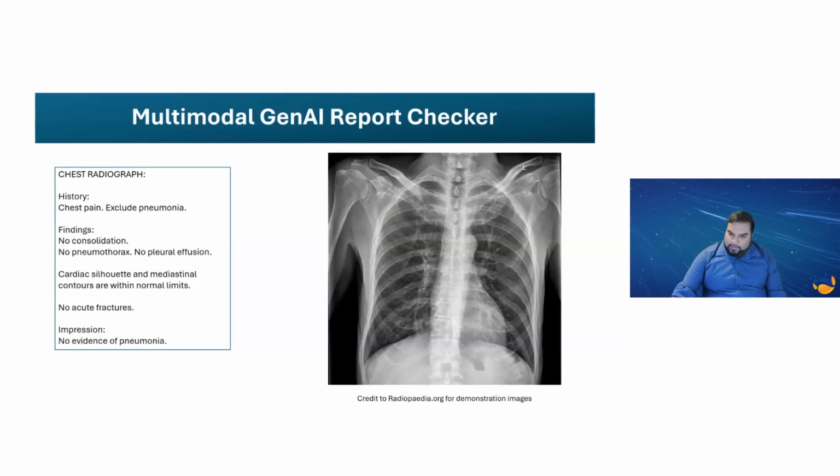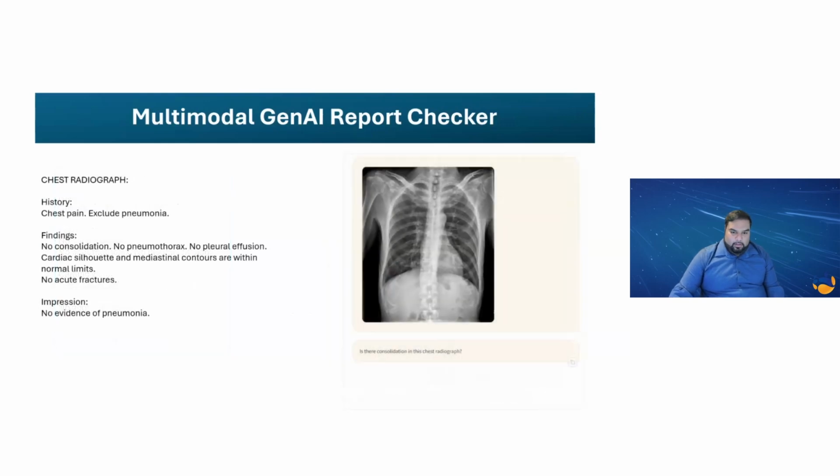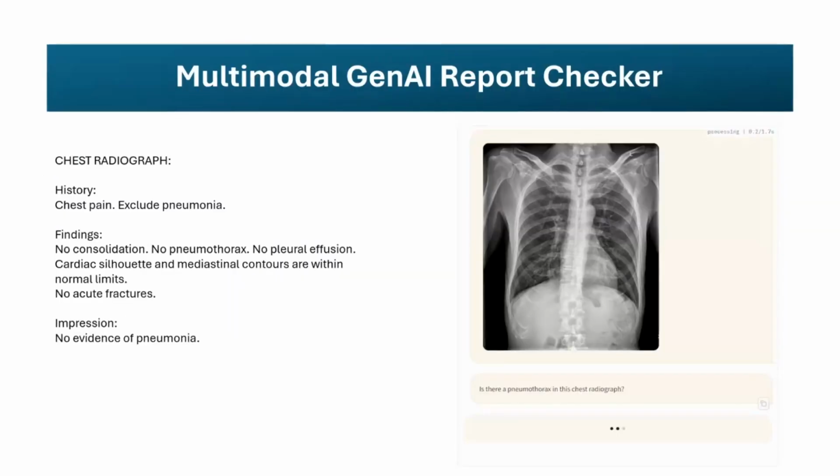For everyone that thinks that this sounds like alien technology, here's an example of a project where a research group trained one of these open source models I mentioned with radiology data. So it's asking the question, is there consolidation? No. Is there pneumothorax? No.